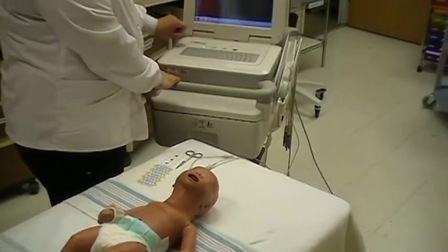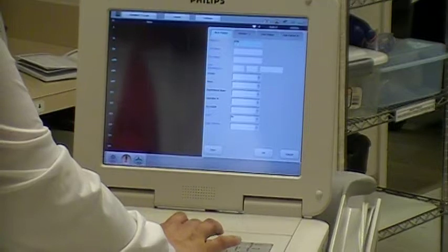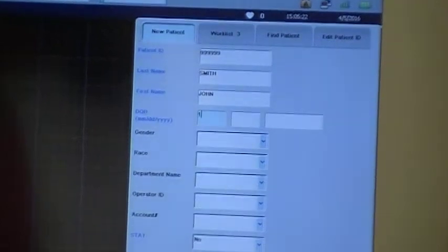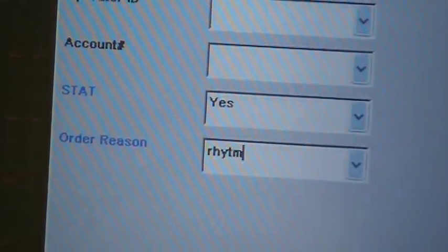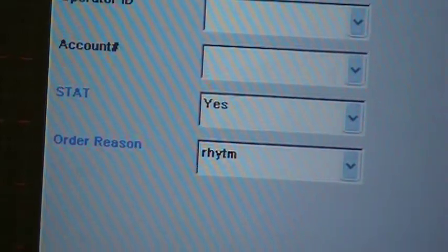The child's last name, first name, date of birth, gender, and reason for EKG are all entered. Only the blue fields are mandatory fields. Note that this is a stat EKG.